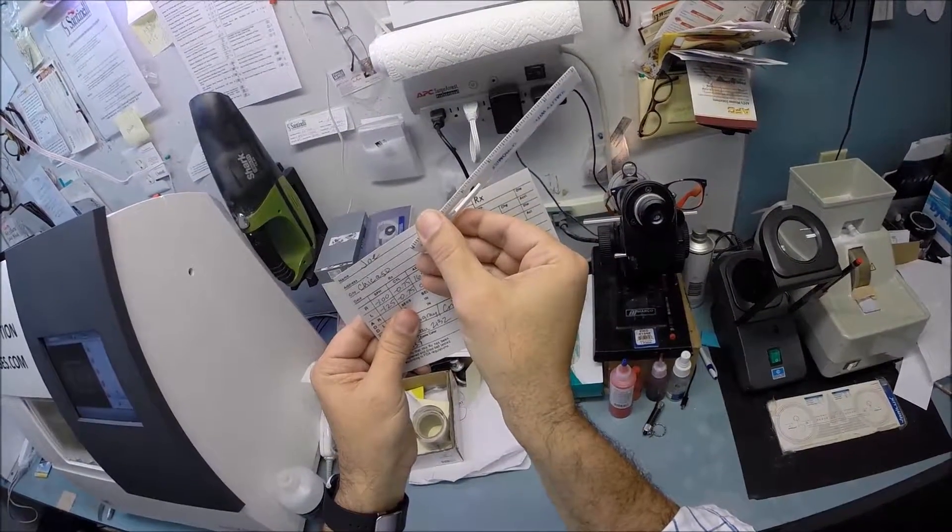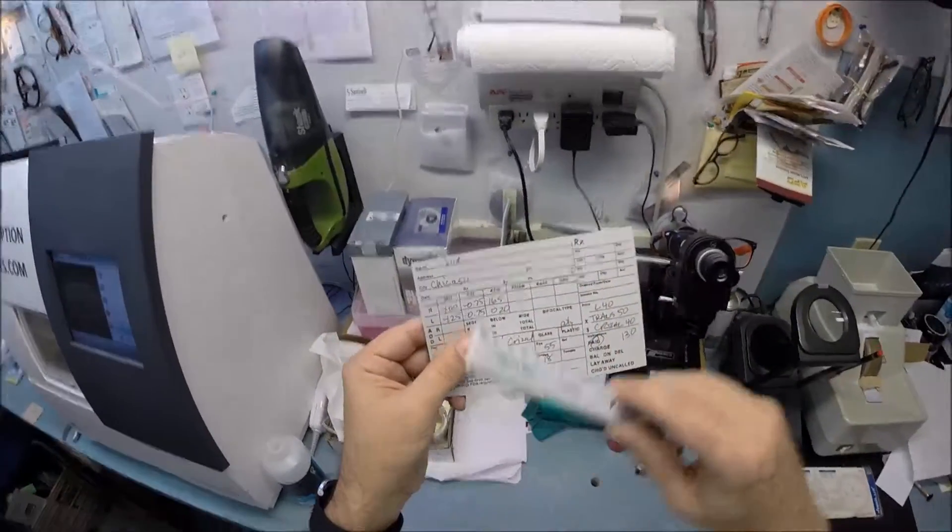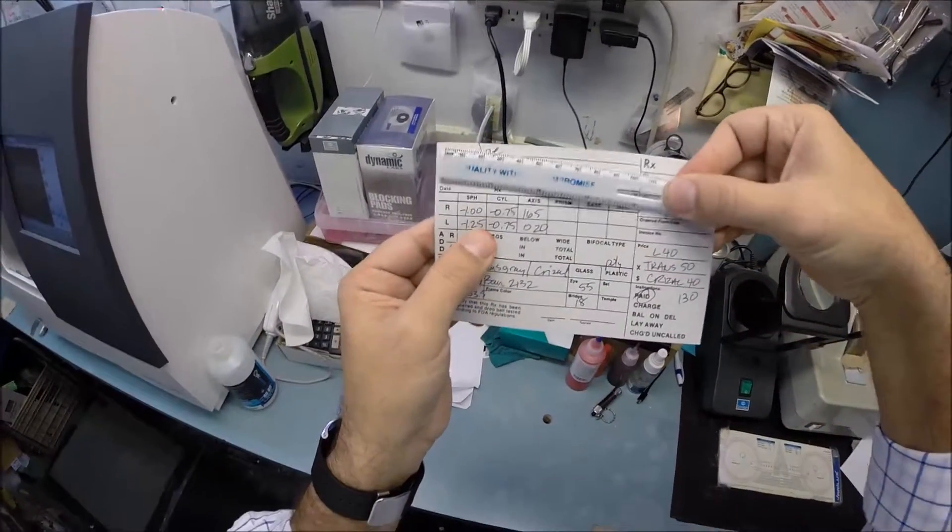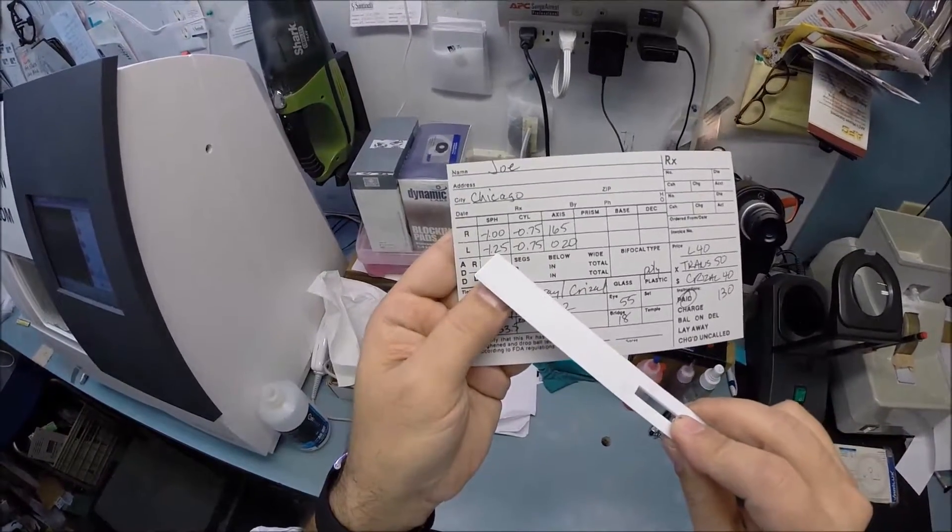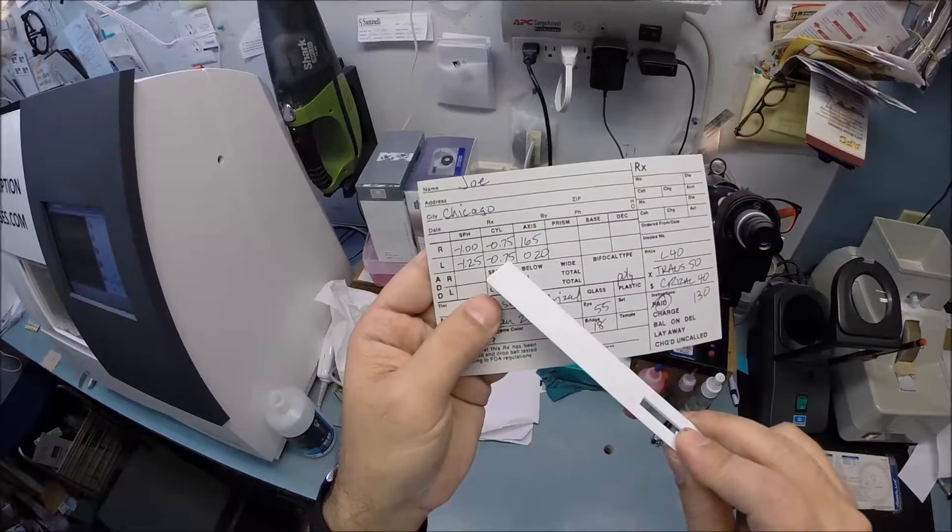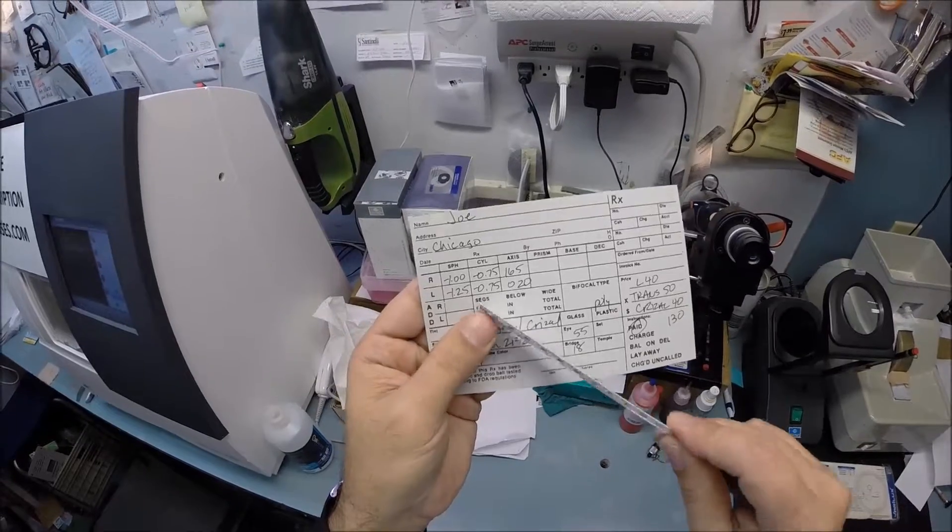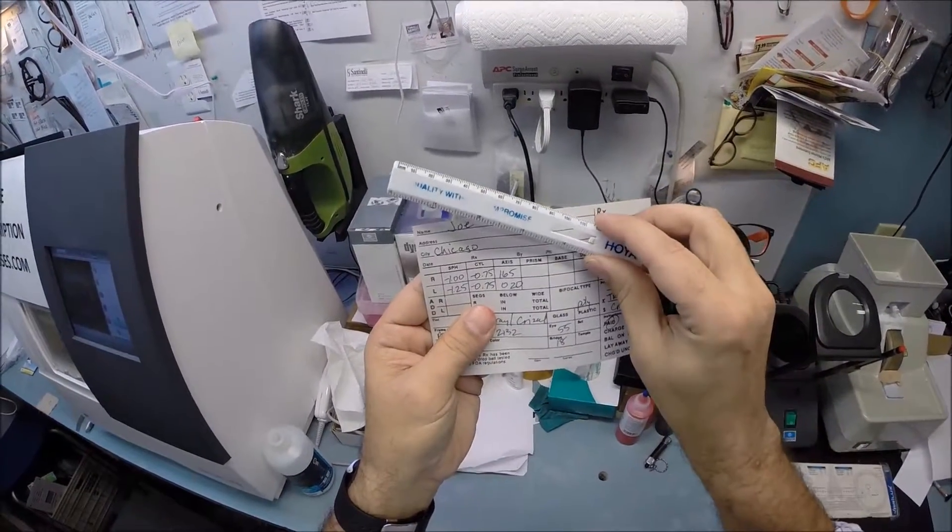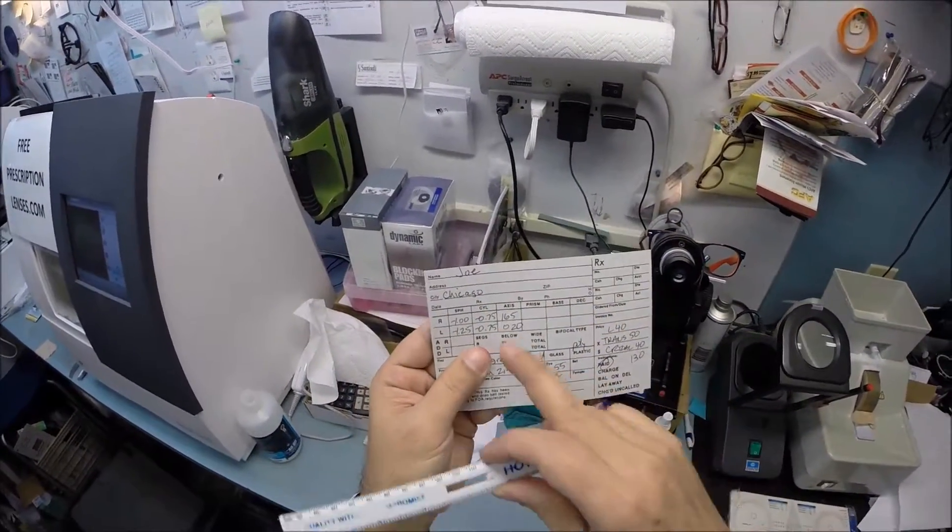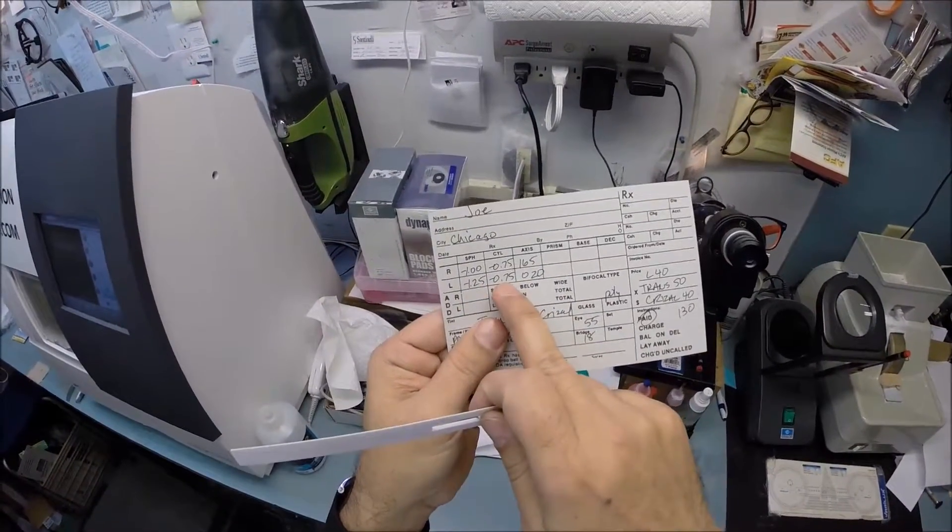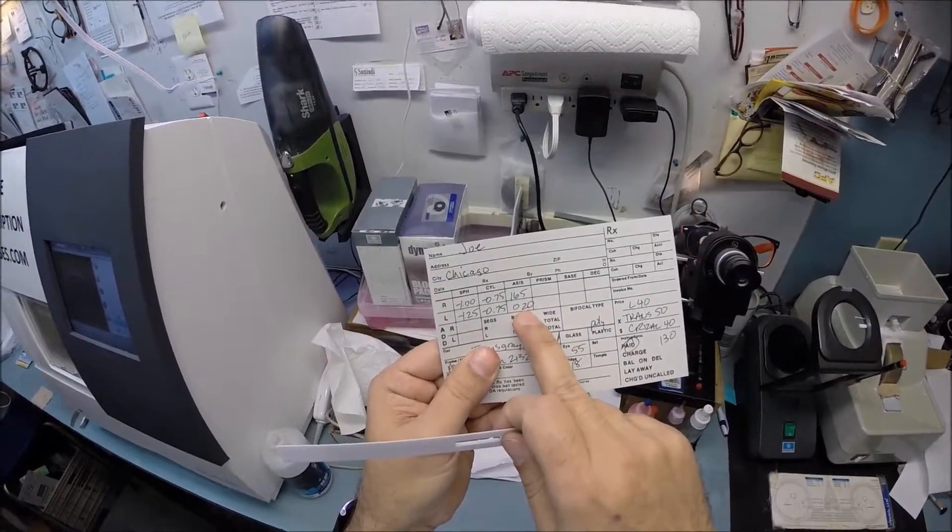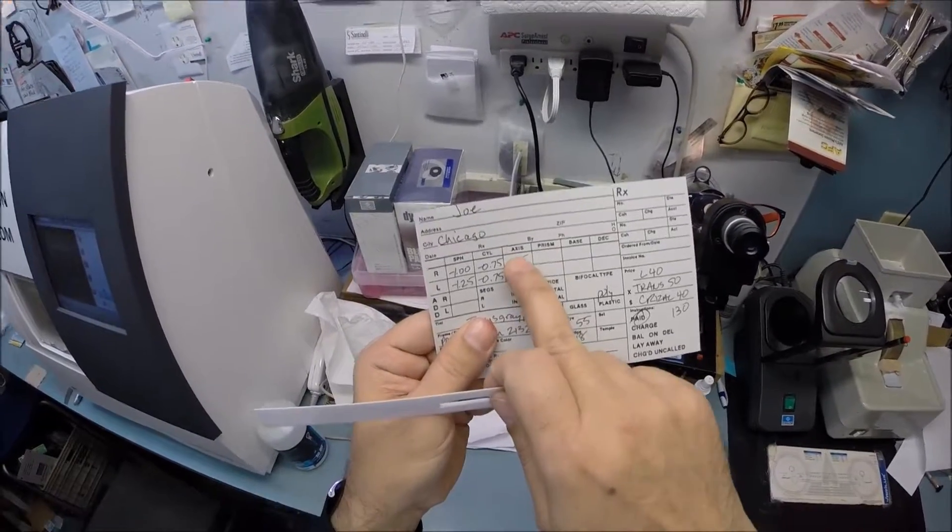Your left eye reads minus 1.25 minus 75 at 20. You need five steps of correction for your left eye, still three steps of astigmatism correction, but we're only going to turn that knob to 20. Now 165 and 20 seem far apart. These first two numbers are real values. This last number could be anywhere from zero to 180 - that is your axis.